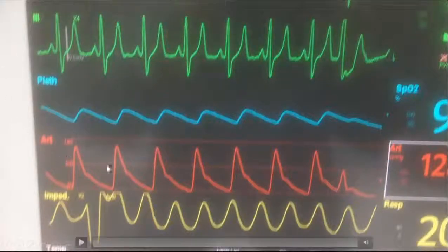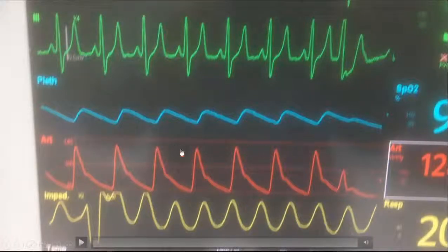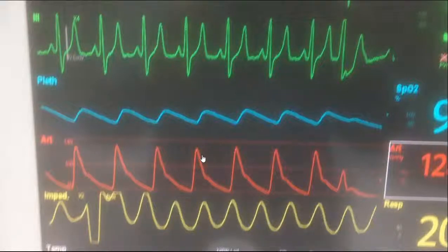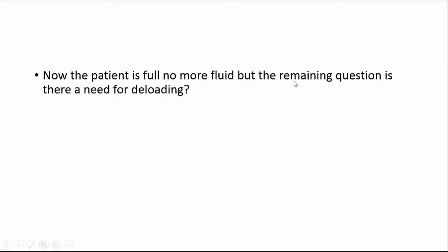We inserted an arterial line and assessed pulse pressure variation — there is almost no variation. At this point, we can confidently say the patient is full and does not need extra IV fluids. But another question remains: should we consider diuresis with furosemide?